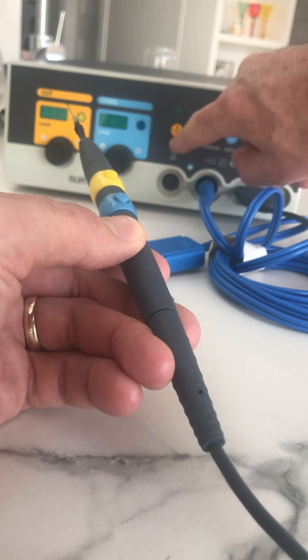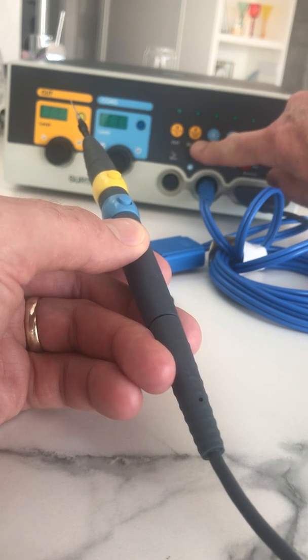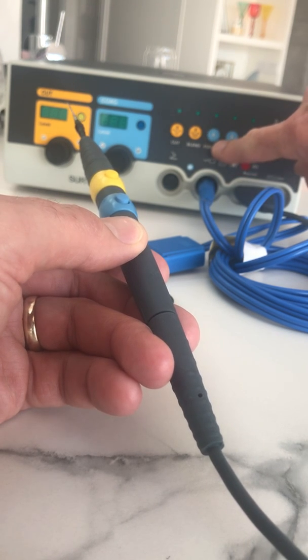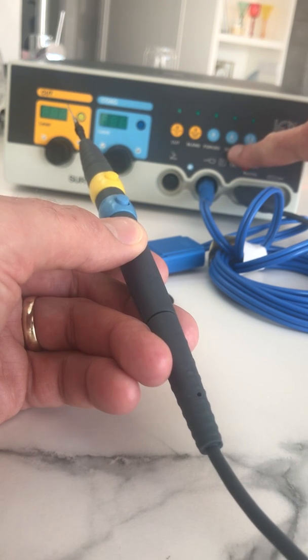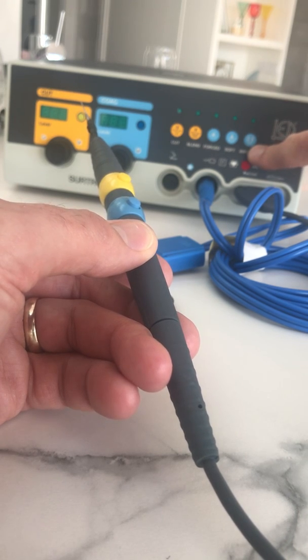On the unit itself you've got: pure cut, blend — bit of cut and coag together — forced coag, which is a more shallow signal, soft coag which goes into deeper tissue, and then bipolar which we'll get to soon — that's when you're using bipolar forceps.